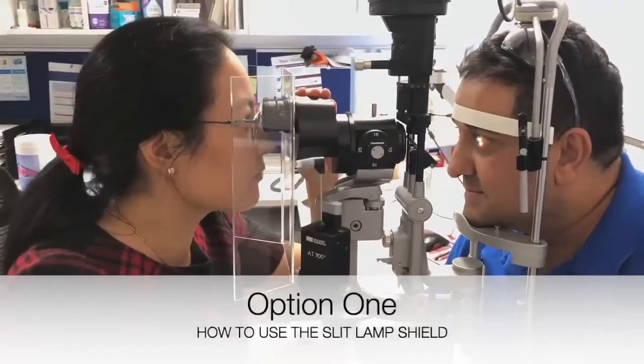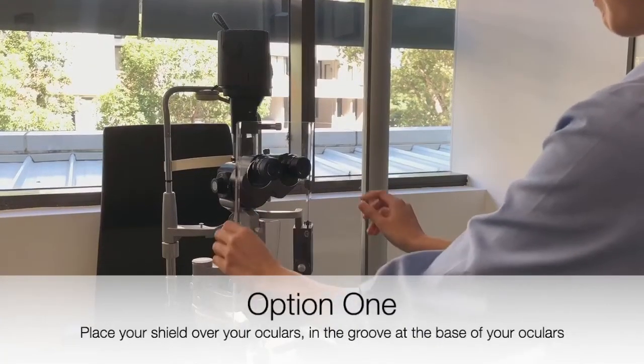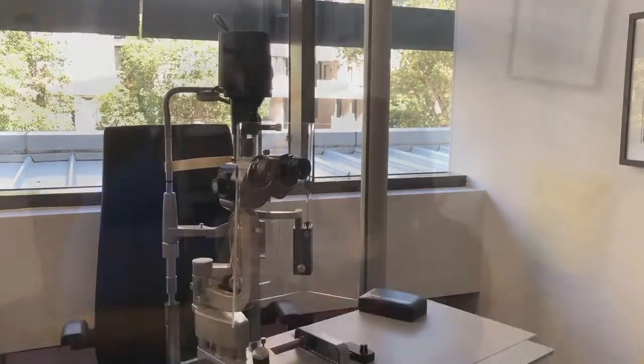How to use the slit lamp shield? Option 1: Place the slit lamp shield gently over your oculars in the groove at the base of your oculars.